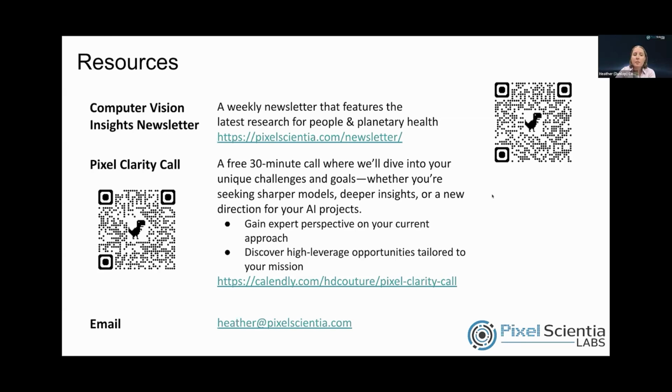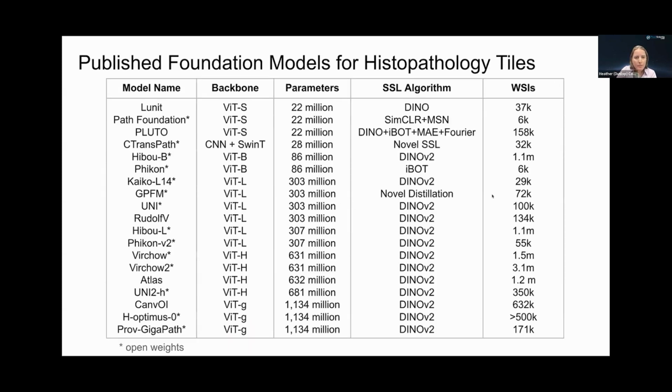So you're very right to be concerned about that, but the good news is the majority of them are available, open weights. You would have to check the exact license as to whether you can use them for commercial use or research only. And this is just one example, and this chart is outdated. I put this together, I think, in January. So there are definitely more foundation models since then, and these are only tile-level ones. The ones with the asterisks have open weights. So that's the place to start, and you can see a significant number of them are available for at least research use.